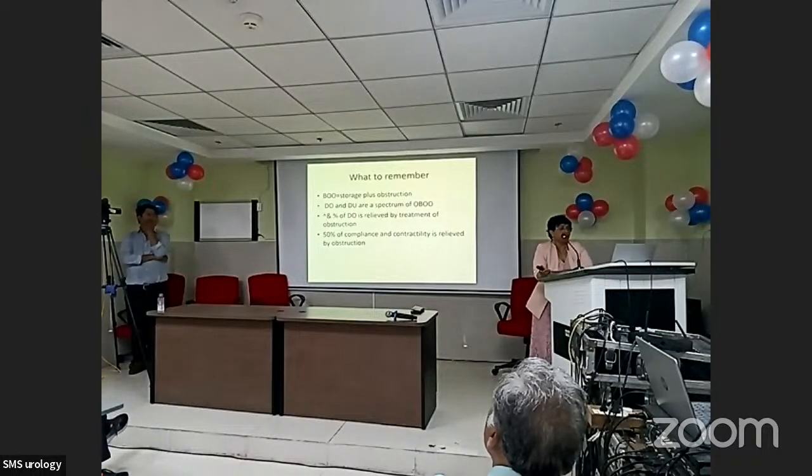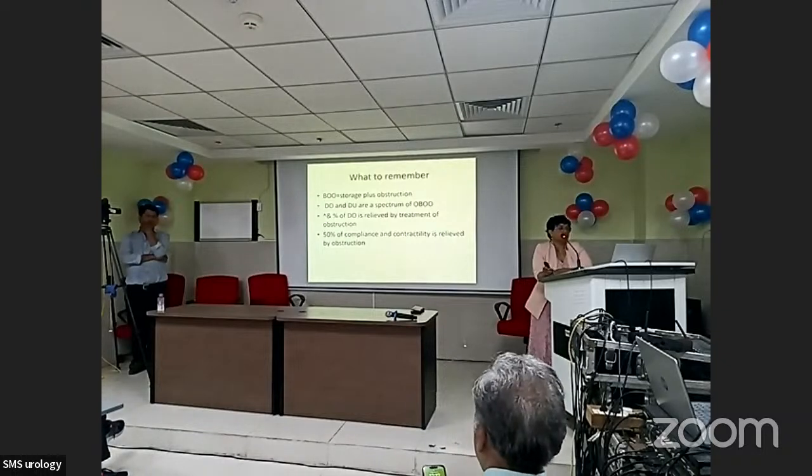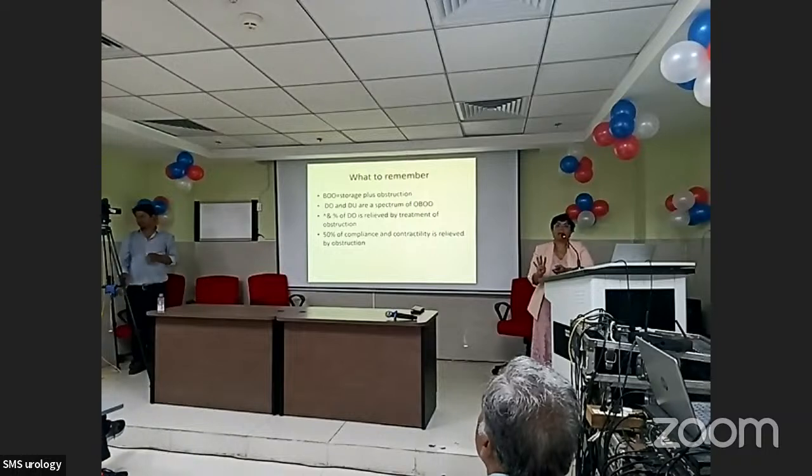So what you want to remember is that bladder outlet obstruction is equal to storage and obstruction. Detrusor overactivity and detrusor underactivity both are a spectrum of bladder outlet obstruction. So bladder outlet obstruction doesn't only come with high detrusor pressure, low flow. No, it may also be associated with overactivity and detrusor underactivity. Both these things can happen in the presence of obstruction.